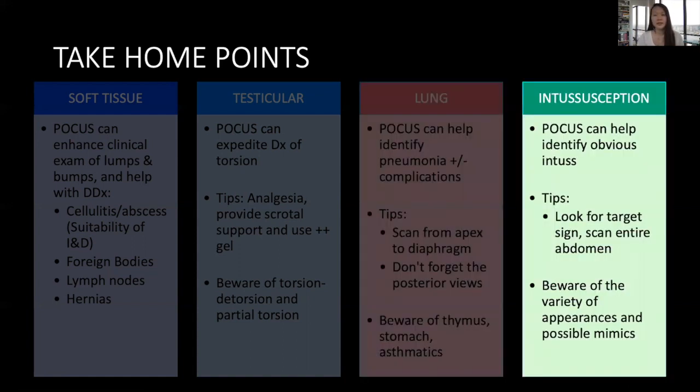Lastly, POCUS can help you identify obvious intussusceptions. Remember that you are looking for the target sign that's classically in the right upper quadrant, but you should really be scanning the entire abdomen. And beware of the variety of appearances and the possible mimics.